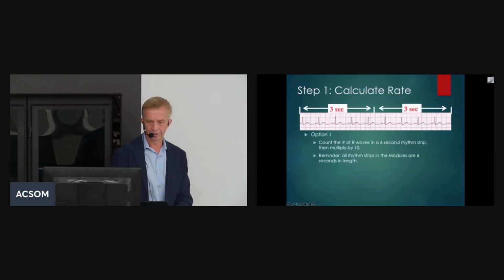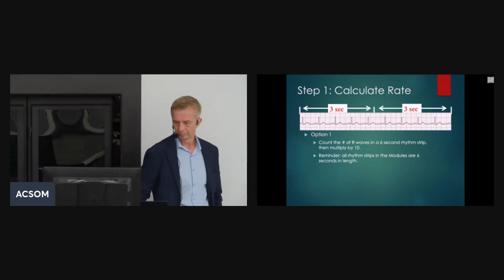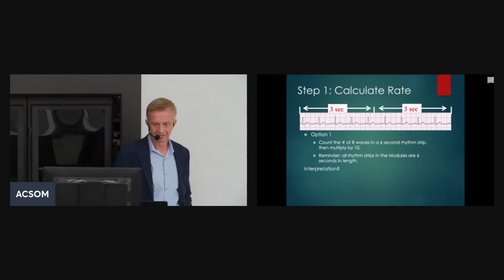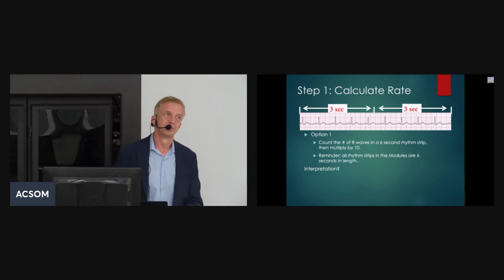How do we calculate the heart rate on the electrocardiogram? There are different ways, right?